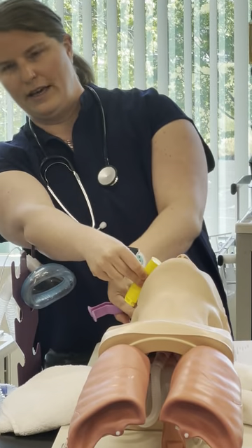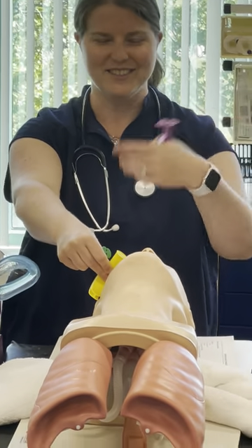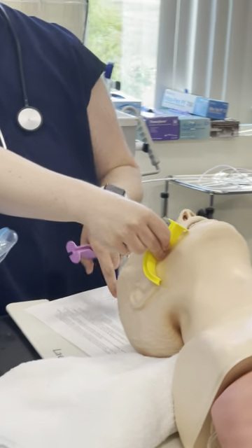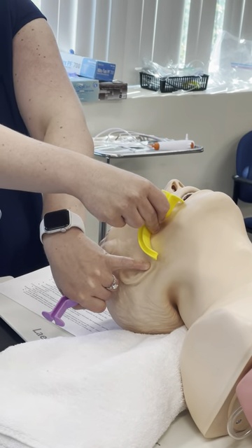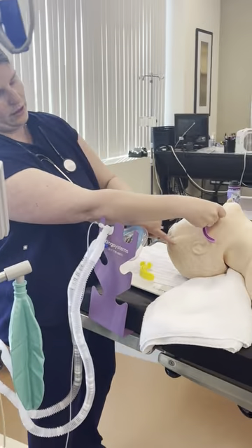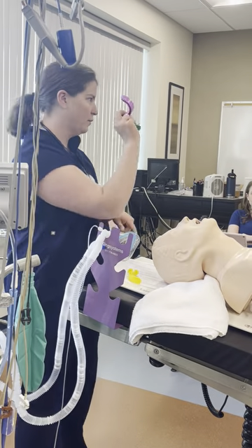You can see that this OPA would be too small for this patient because the tip is sitting above the earlobe. With the size 100, the flange is at the corner of the mouth and the tip is now at the earlobe — so this would be the appropriate size.